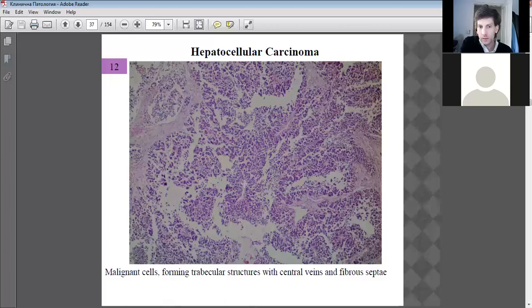This here is an example of a trabecular structure there, but it's really shrunk in size there, okay, and collapsed. There's a lot of fiber that's beginning to remain though, as a result of the death of the tissue. So eventually you get mostly fibrous mass, and the tumor becomes a big fibrous mass, if you like, hard mass. So it's quite a good slide, very good slide of the atrophy as a consequence of the carcinomic properties.